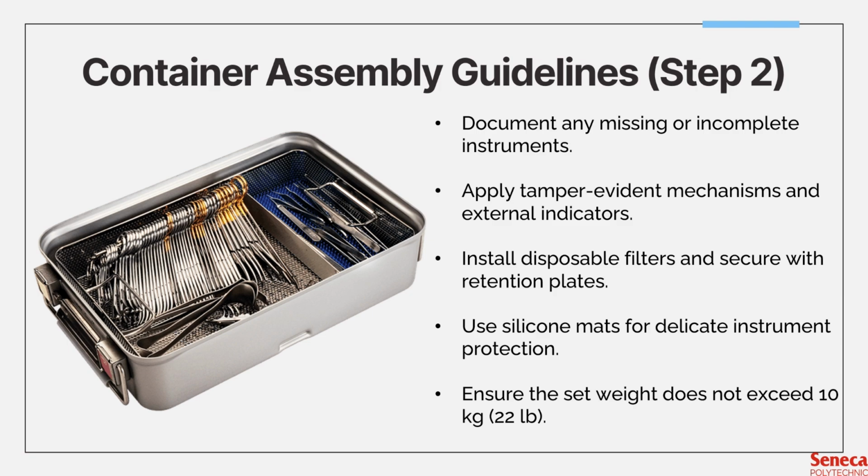And of course, exceeding this weight limit can actually affect drying efficiency and safety during handling. And for that reason, if you were to sterilize any sets exceeding the weight limit, you would have to let it dry for a longer period of time.